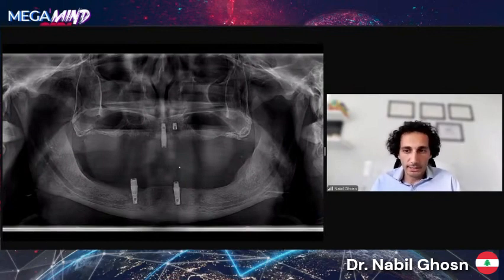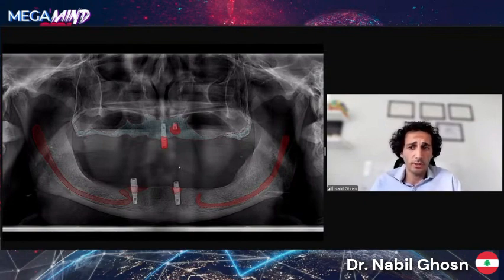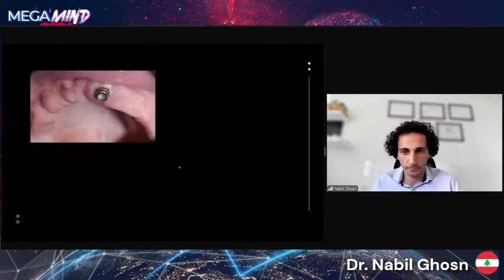While viewing the panoramic X-ray, we noticed the severely resorbed maxilla with the failed implants and also an advanced pneumatization of the sinuses. For the lower arch, we noticed that we have limited posterior bone height above the nerve and bone defects around the placed implants. It was decided that we start with the removal of the failing implants in the upper jaw, put a temporary upper denture, and wait for the CBCT in order to take decision regarding the lower implants and do the appropriate treatment plan for both jaws.